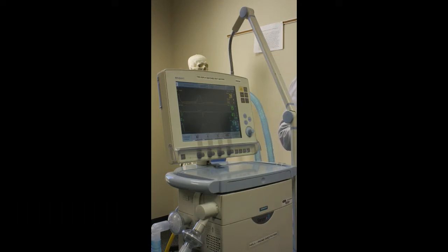So respiratory rate. You're going to see this done a couple different ways. You can either see mandatory rate. This one just says respiratory rate. This is how many breaths the ventilator is delivering. So if we're set at 12, it should be giving 12, ideally.